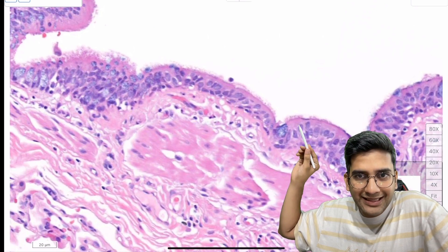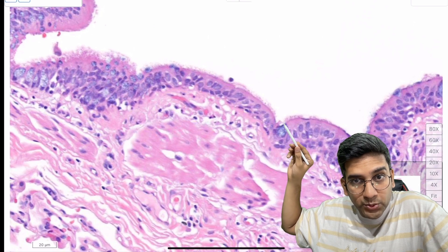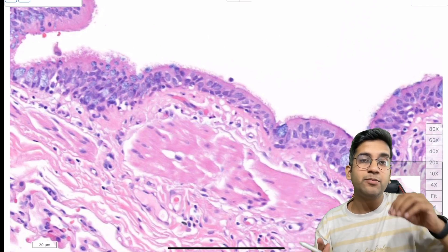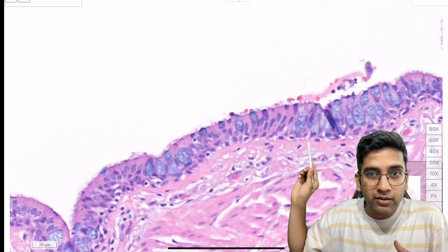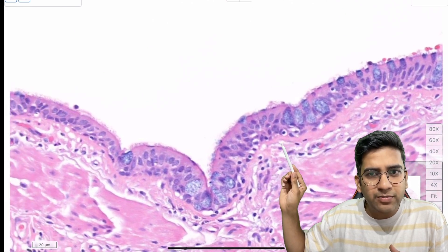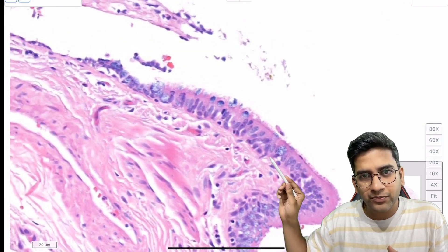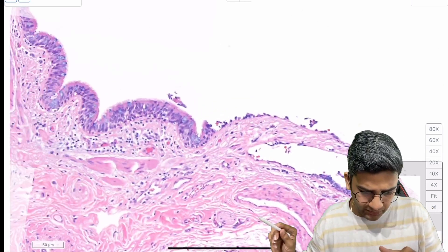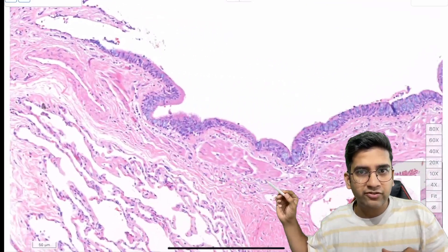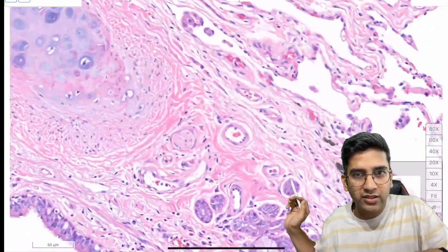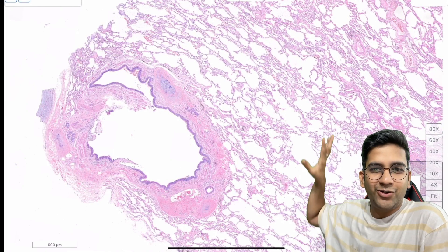You can appreciate the tiny cilia on the columnar cells. Wherever there is a mucin-secreting cell, you won't have overlying cilia. The bronchial basal layer is often ignored — look at it: a beautiful layer of single, extremely dark nuclei with high NC ratio. Kulchitsky cells are really difficult to identify, but if you see a little bit of cytoplasm, that may indicate one. Below the epithelium you have bronchial smooth muscle, mucus-secreting bronchial glands, and cartilage.